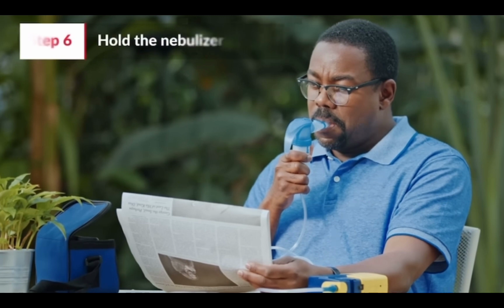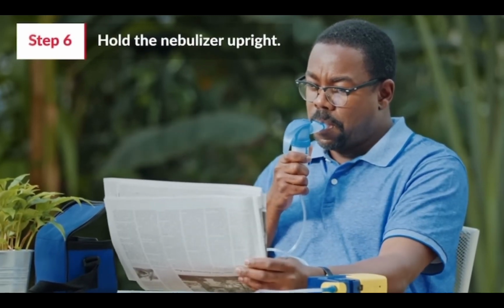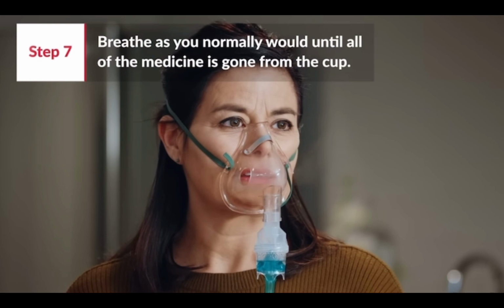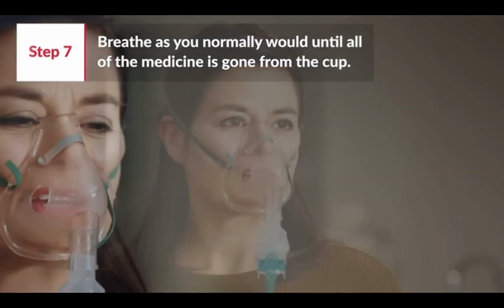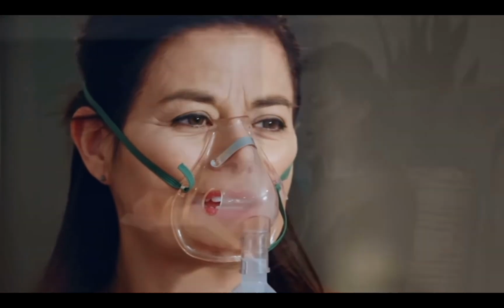Hold the nebulizer in an upright position to prevent spilling and to ensure the medication is correctly distributed. Take normal, regular breaths in through your mouth so that the medicine can go deep into your lungs. Continue until all of the medicine is gone from the cup.